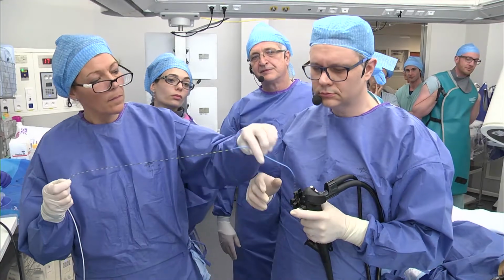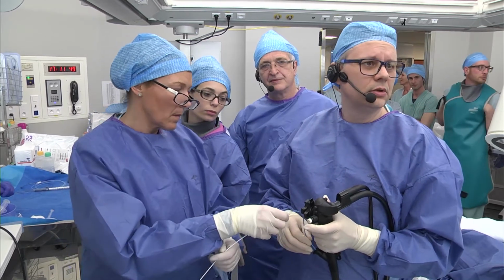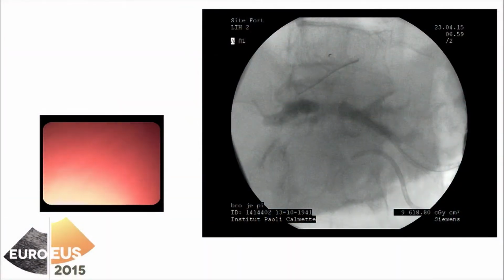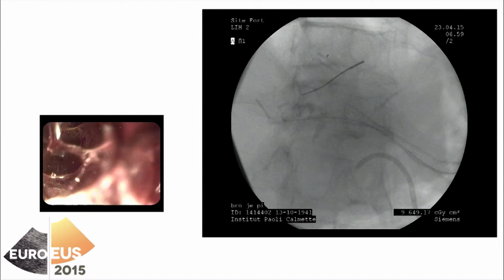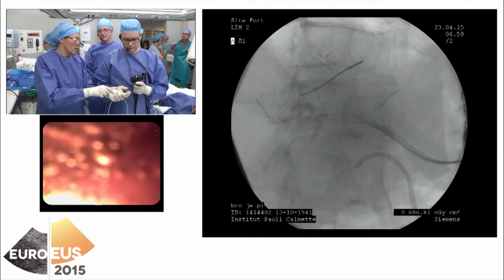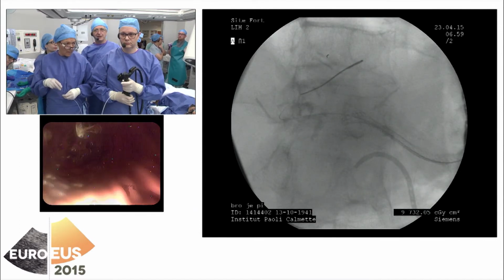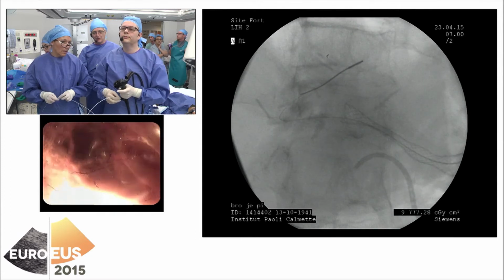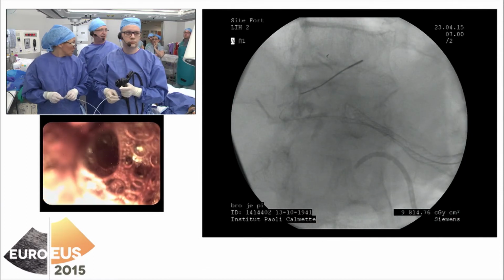Do you put a mark on the middle of the stent? I'm sorry, if you ask a question, I didn't catch it. You put a mark on the middle of the stent with a pen. Okay. Yes, with an ink pen. There are some stents which are pre-marked, but usually the nurse makes the mark immediately before, with a black marker. And it's important to wait a few seconds to allow it to dry a little bit before pushing it.